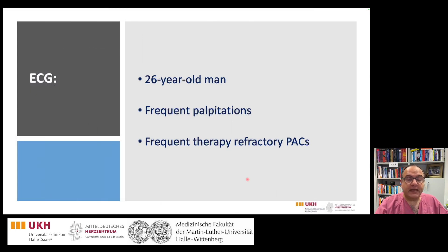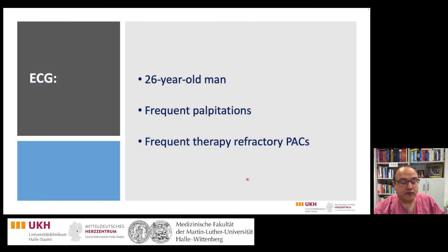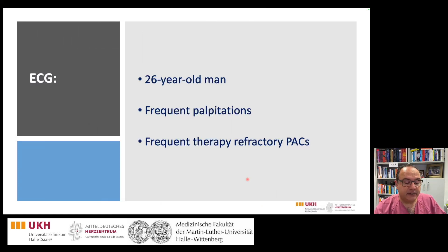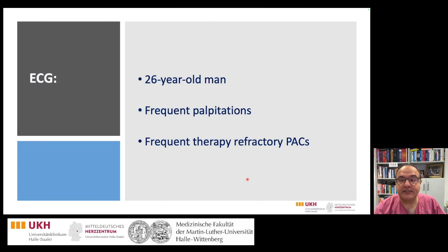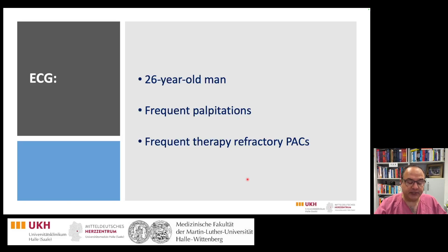The today's ECG belongs to a 26-year-old man who was admitted due to frequent therapy-refractory premature atrial contractions for catheter ablation.